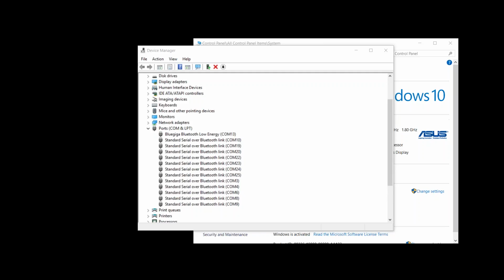So we can give you also the validation document, and we have material coming regarding that. Specifically about the zones, actually I can't answer you that myself, but I'm sure it will be in the material just as the muscle fatigue threshold. So yeah, we have material coming about that.